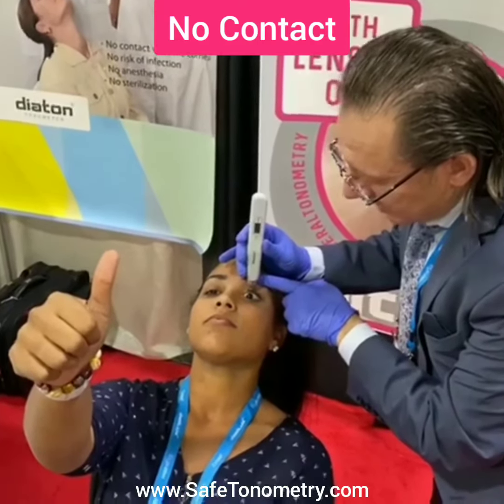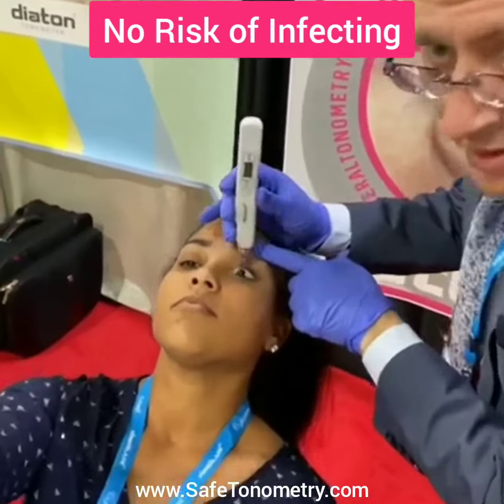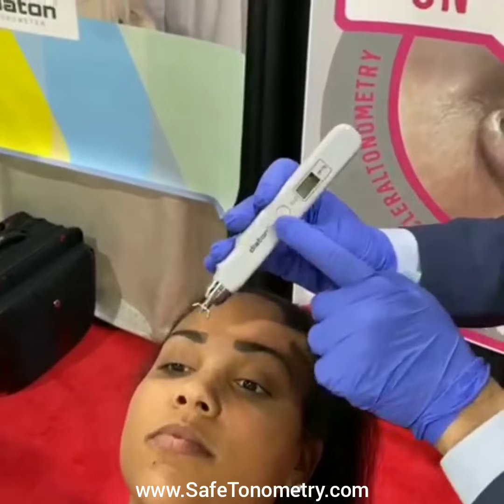And we're going over the eyelid. If you don't mind zooming in a little bit, you will see one and two. So we're taking the reading.